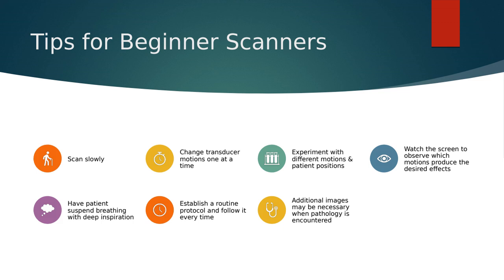You want to make sure that you are watching your screen and that you begin to learn to trust your hand. Let your hand do what it needs to do. Your hand is going to go through those motions, but if you're watching your hand, you're not seeing what that movement of your hand is doing on the screen, and that's the most important part. You have to be watching the screen and see how those slow movements affect the picture. See how much better or how much worse certain experiments are when you start changing your position.